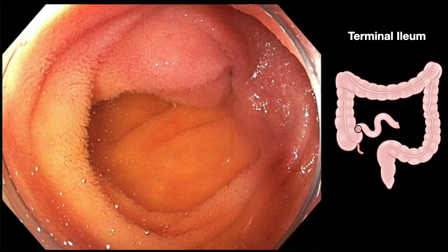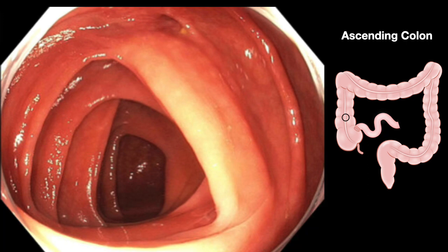So when we reach the cecum, we should take at least 3 photographs. One photograph to document the appendix, base of the cecum, ileocecal valve, and for sure document the photograph of the terminal ileum, which will be the most convincing evidence of you reaching all the way to the beginning of the colon. Next, as we come back, here is the ascending colon, and in the distance you can see the ileocecal valve.